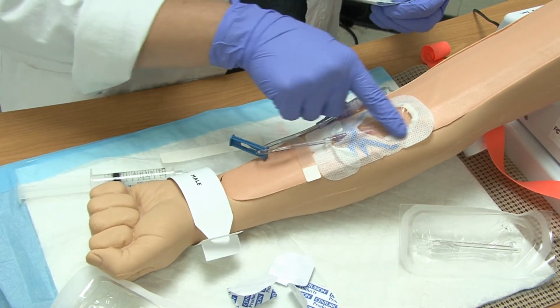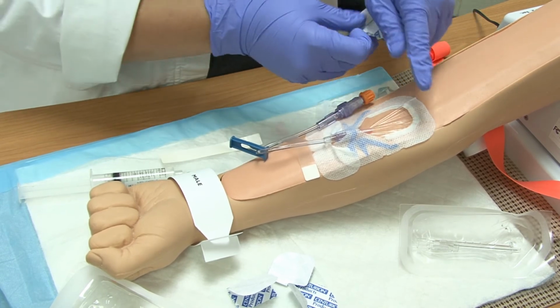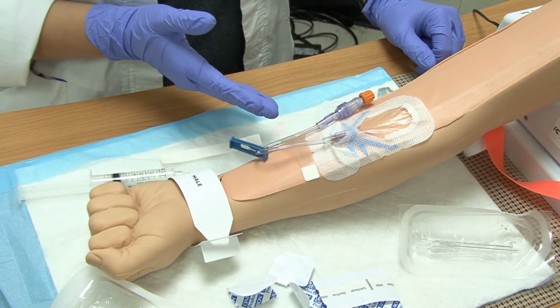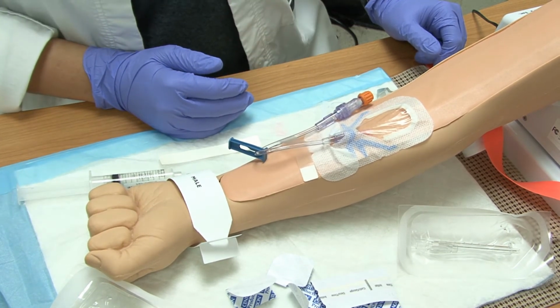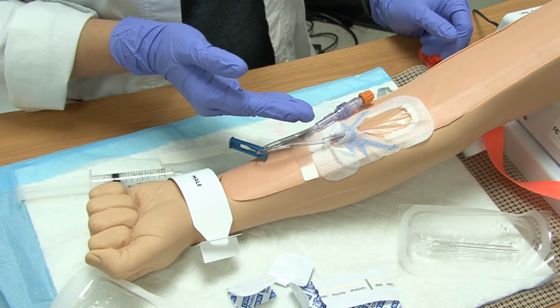You never want to put it over the top of the window of the securement device because you cannot see your actual insertion site. So I would have date, time, initial, and gauge on it. You always want to come back through and reassess your site and make sure your patient's not having any pain here. You want to make sure that there's no swelling or redness.